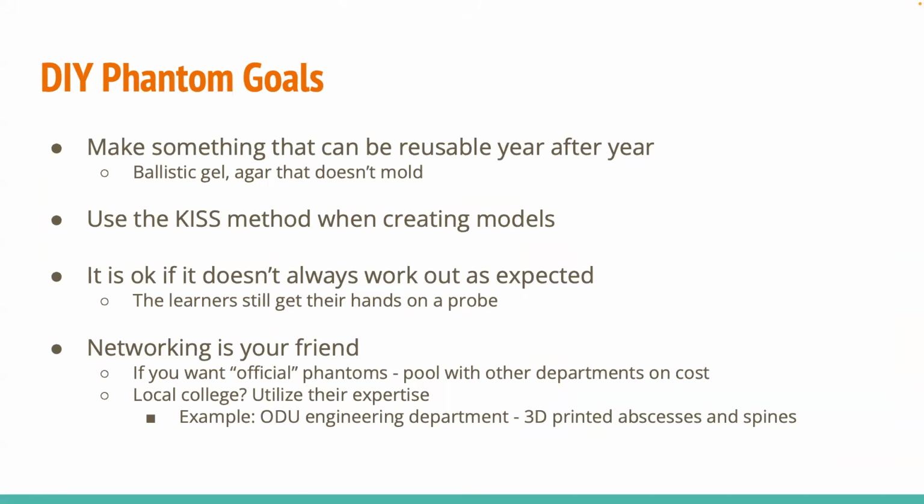Do keep it simple when you're creating models, and you don't just have to use that one website. YouTube is full of different DIY phantoms. And if it doesn't work out, like if you try it and think, I think it worked at home, but in real life it didn't really work, that's okay. People are still getting hands-on.